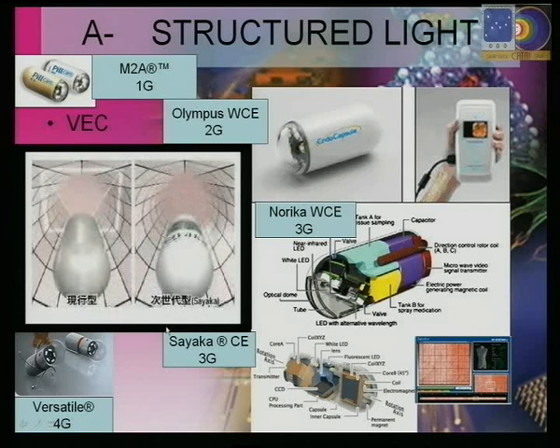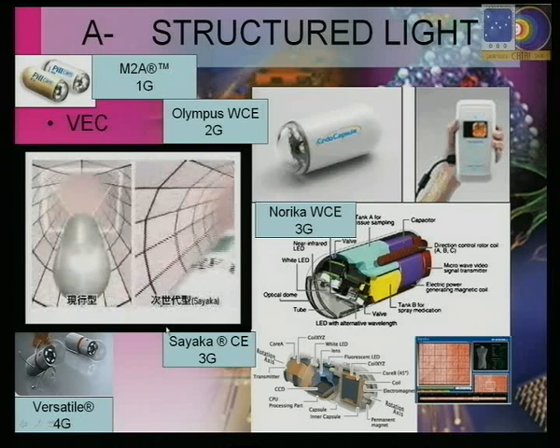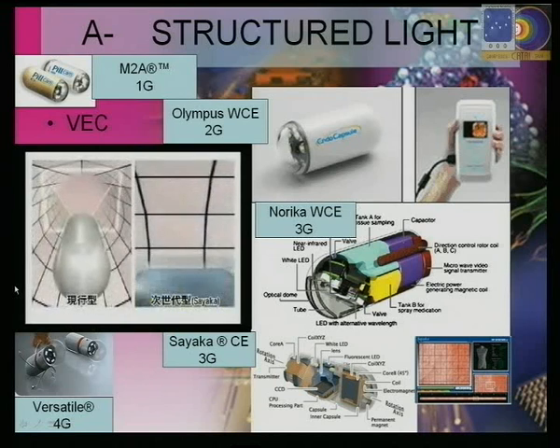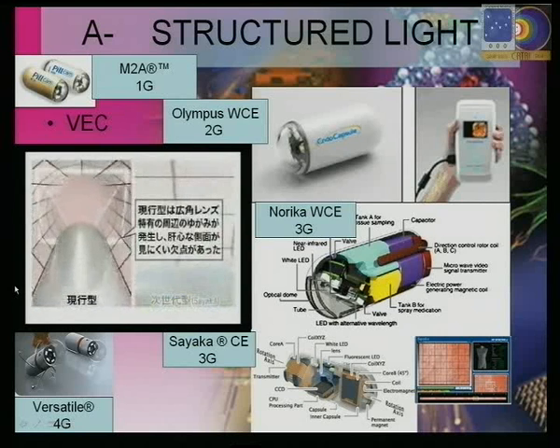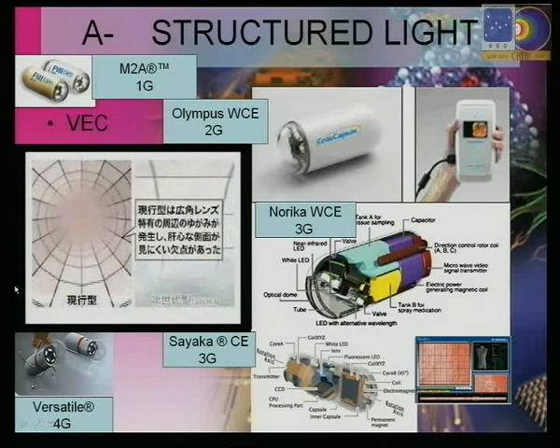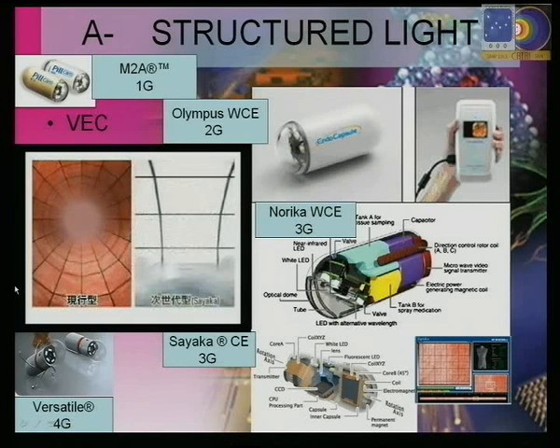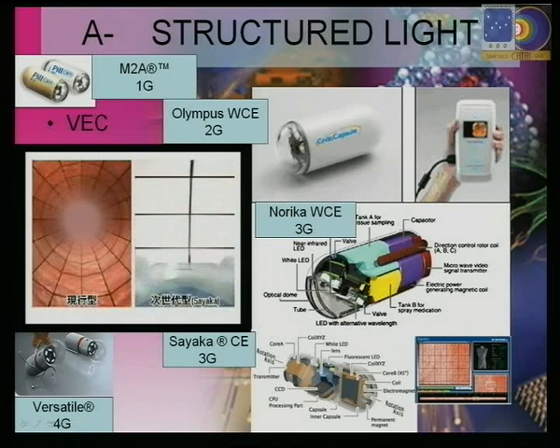One of the problems of these capsules is they can get stuck somewhere. In order to avoid the capsule being lost, not because it's a problem to lose it, because it doesn't matter, now I think that they reuse it. Initially it was one use only. The problem is that they can block the gastrointestinal transit, particularly when there is a neoplasm.